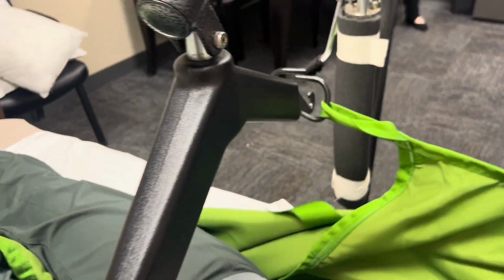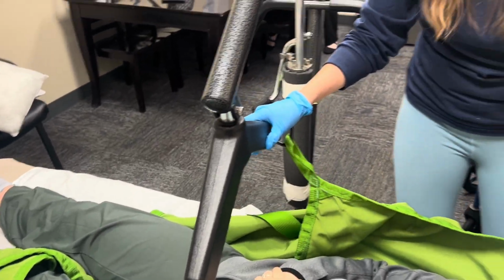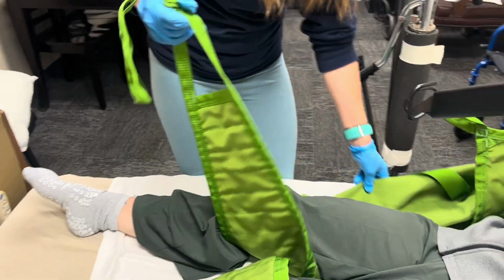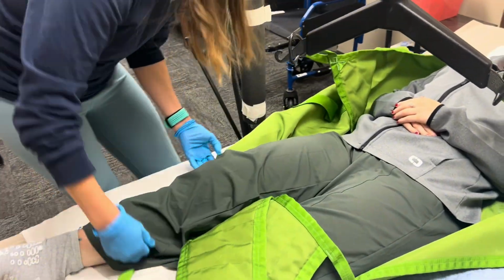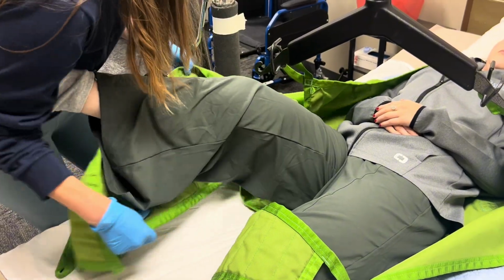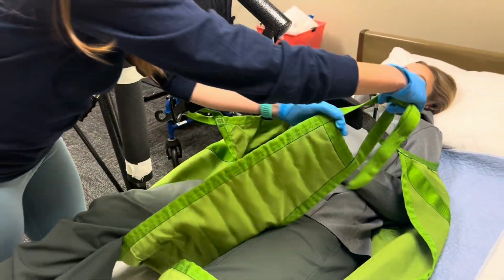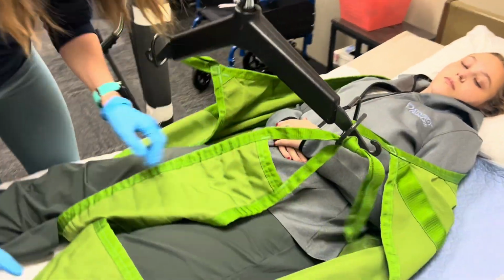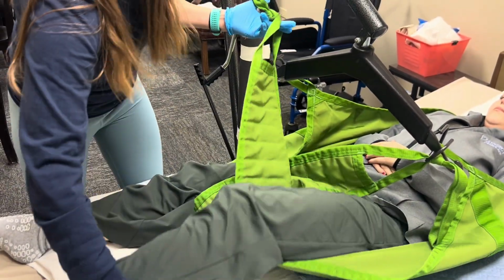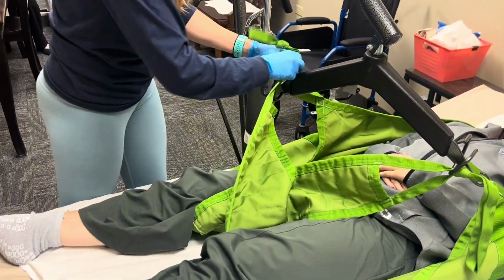Also, another thing when doing a Hoyer sling, you want to make sure that this is kind of high up so that you can support your neck. Now, for the legs, this is the one that's on the right side, and it got crossed over. I just want to make sure I did it right. It got crossed underneath, and it's going to go on the opposite side. This one, and we're going to bend just to show, this is underneath our leg, and it crosses over, so the left strap goes for the right hook.